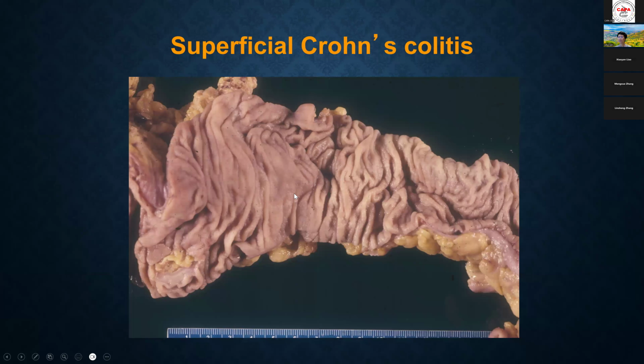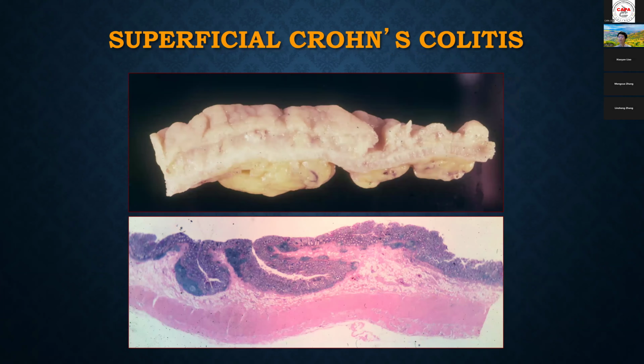So look at this specimen. We can't really see too much inflammation, or anything that looks like Crohn's disease, with strictures, creeping fat, or anything. Even on a cross section, we can see the inflammation is mostly in the mucosa. In some areas we do see some lymphoid aggregates, but it's not really inflamed. And muscularis propria and serosa look completely normal.